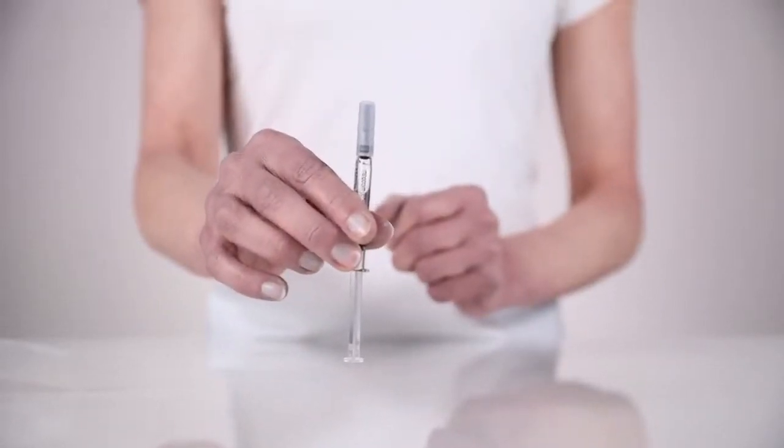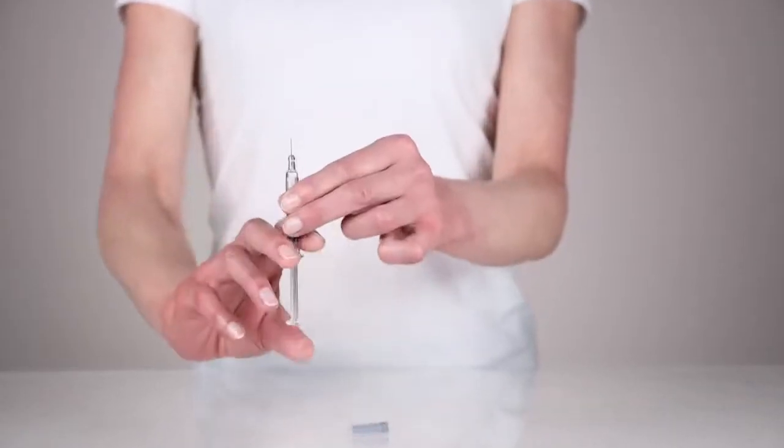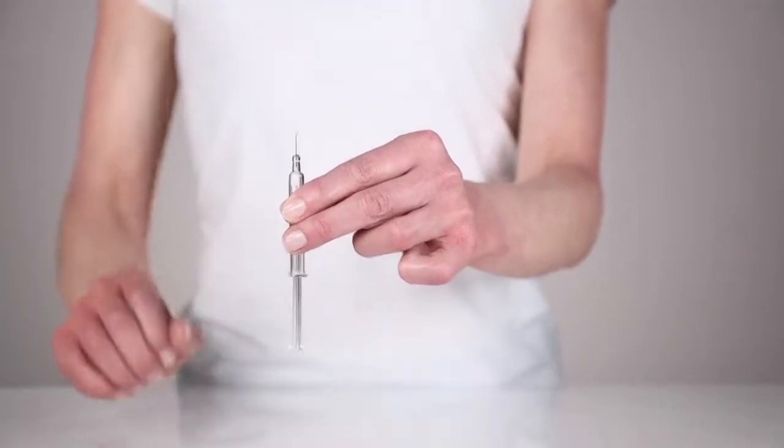Hold the syringe upright with the grey protective cap upwards. Remove the grey protective cap. Gently push the plunger up until the largest air bubble has gone from the syringe.